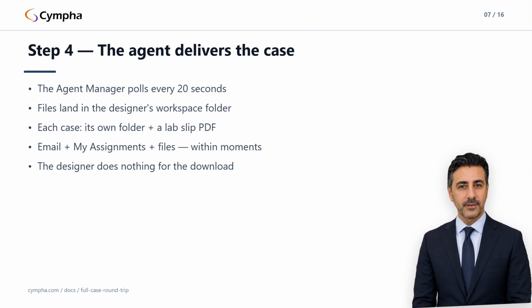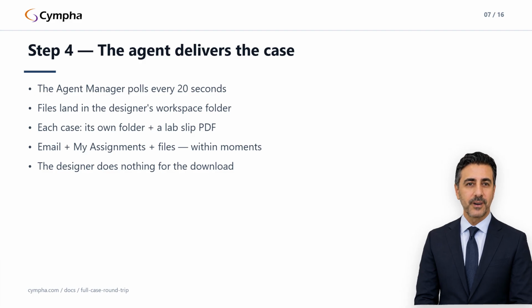The one failure mode: if the agent isn't paired, the download stalls, and everything else looks fine. The Install and Pair Cympha Agent Manager Guide covers pair recovery. Step 5 is the actual design work, and it uses both surfaces for what each is best at.